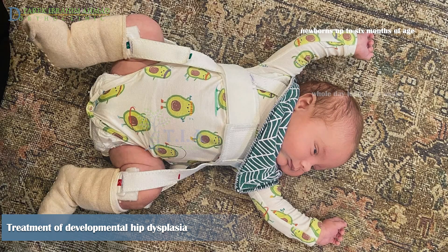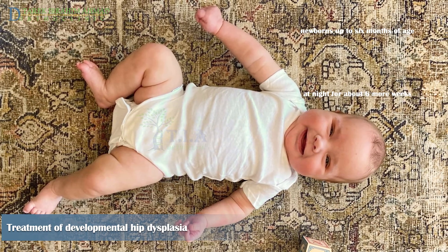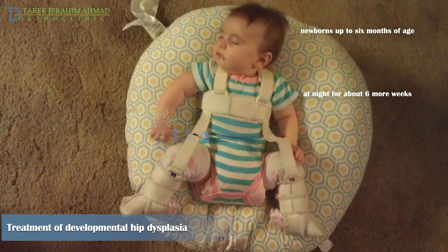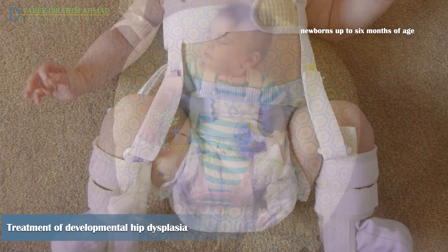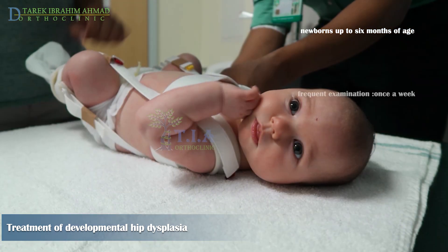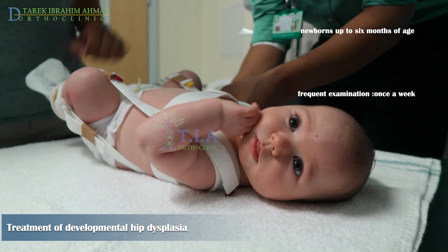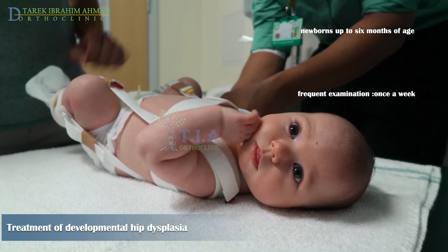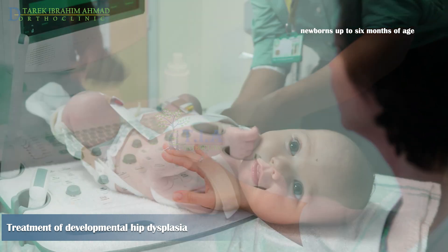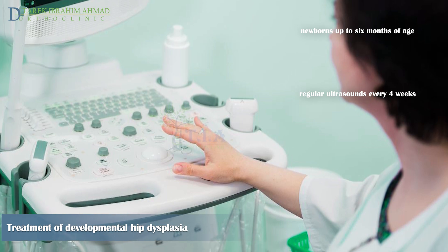Initially, the baby should wear the harness full-time. After about six weeks, the harness can be removed during the day, but continued at night for approximately six more weeks. The harness is adjustable as the baby grows. The child must be examined frequently — usually weekly — to ensure correct application. It is important not to adjust the harness yourself. Regular ultrasounds every four to six weeks are needed to follow hip joint development.